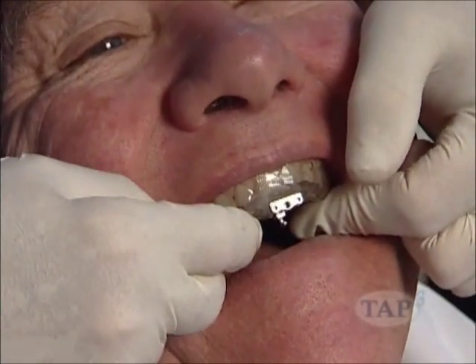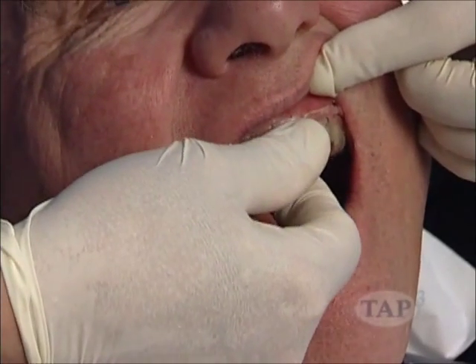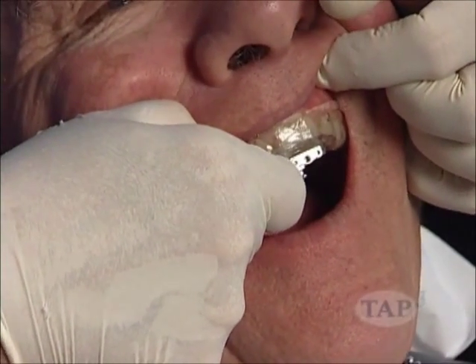Press down with even pressure, especially in the posterior. Do not rock the appliance over the teeth. Some thermocryl will express out of the tray. Remove the upper tray by the hard outer shell. Do not touch the soft lining material. It may distort.